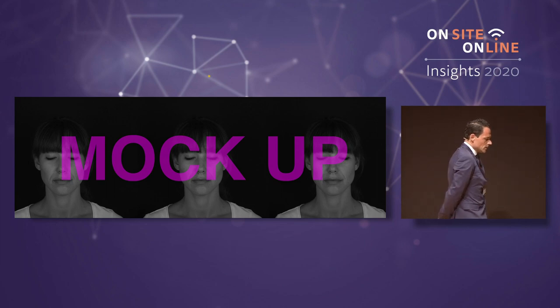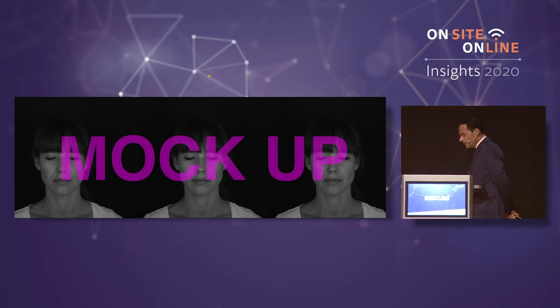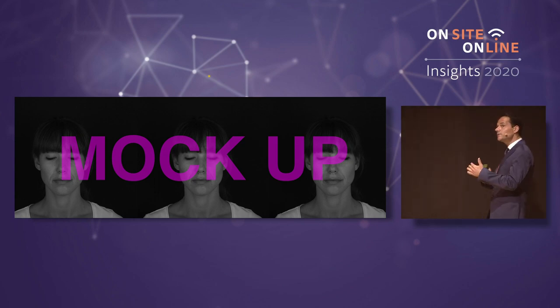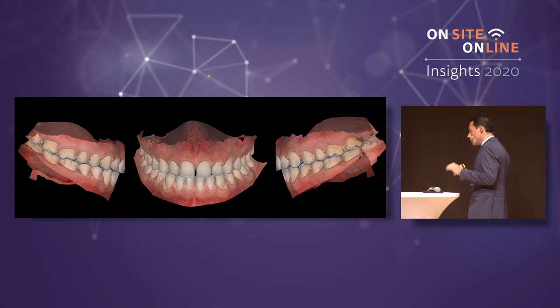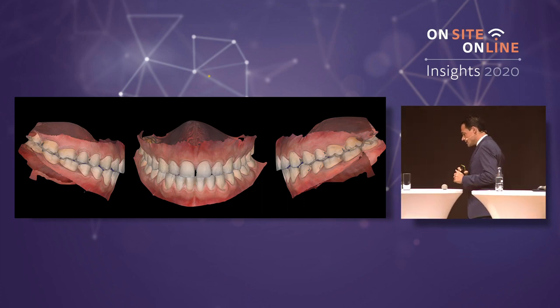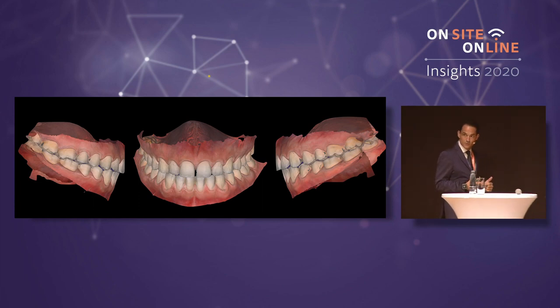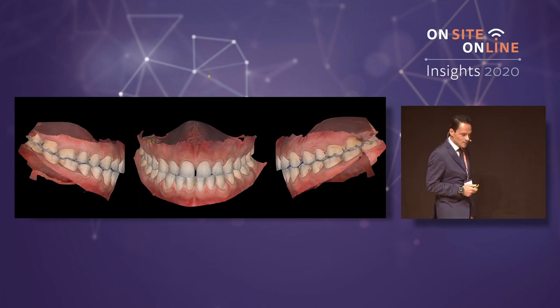I would like to show you this new incredible feature I have found in Galway, because this is not a direct mock-up. It is an indirect mock-up. Let's see. We have decided to increase the vertical dimension by 1 millimeter. I'm going to show you only the mock-up in this patient. The final case will be shown during the SEPA Congress in Spain next November. We are working on this patient right now.